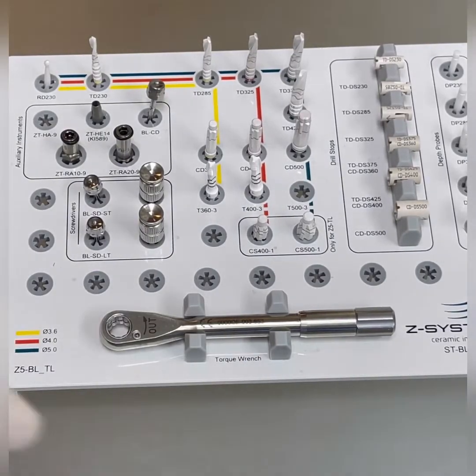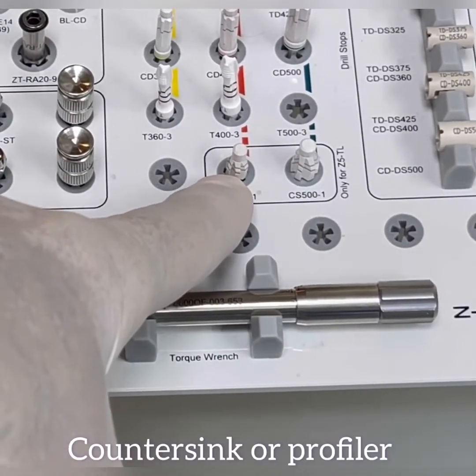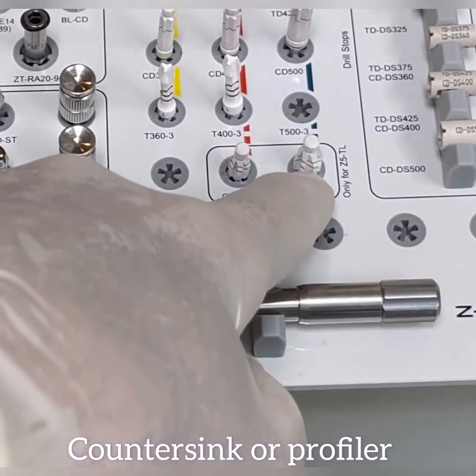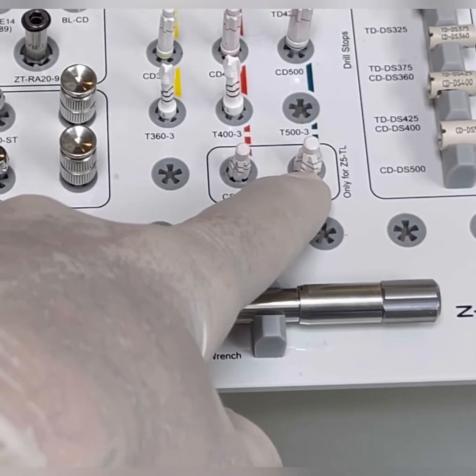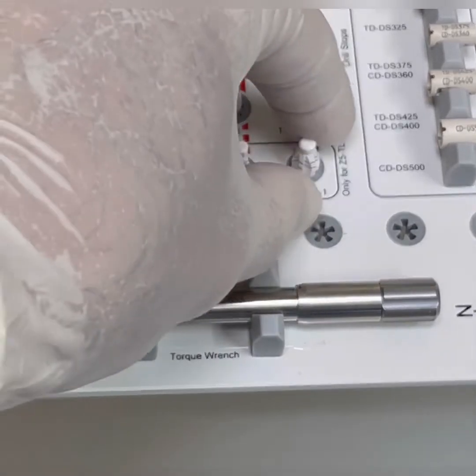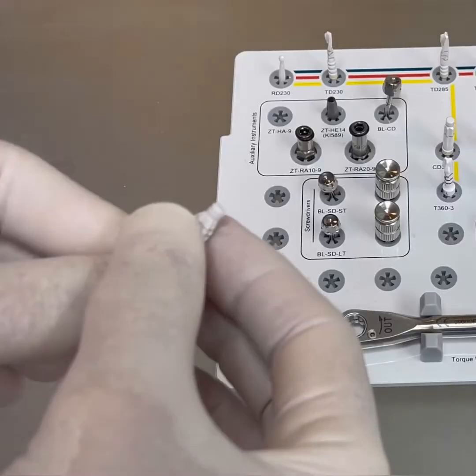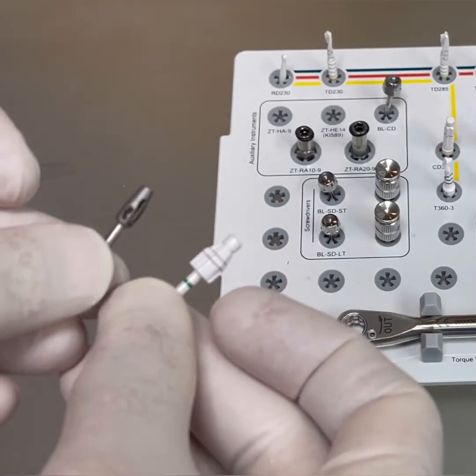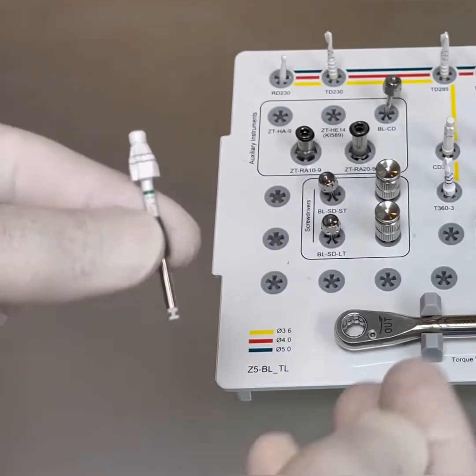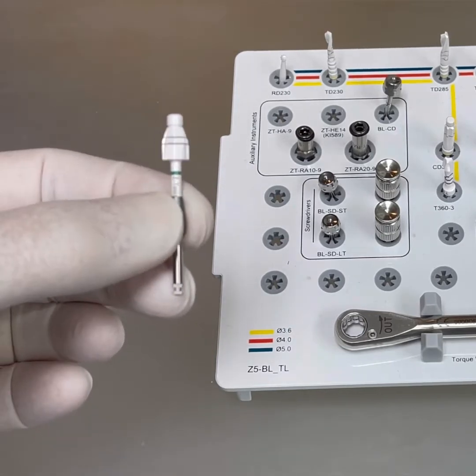The next burr and the last one to discuss is the countersink. Be careful using this — sometimes I use it sparingly. I don't go too deep with it because we still want the platform to be above bone level, so we don't want to sink the implant too deep. These are used at a speed of 400 rpm. Sometimes I have to use the extender along with this to create the countersink.